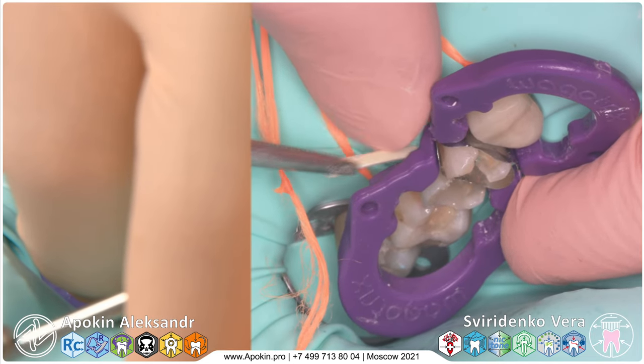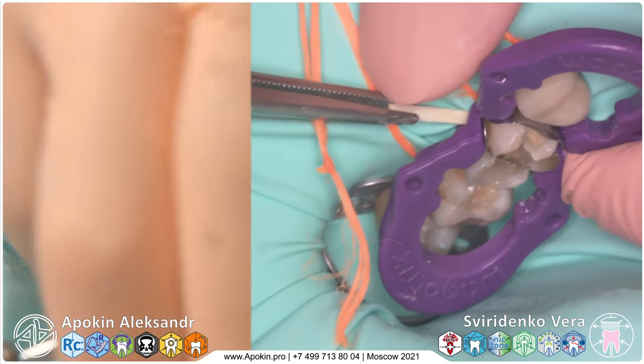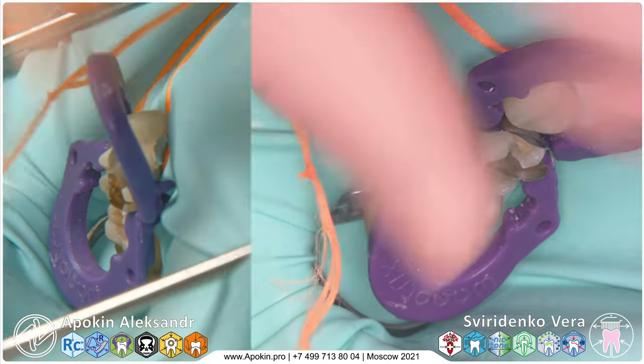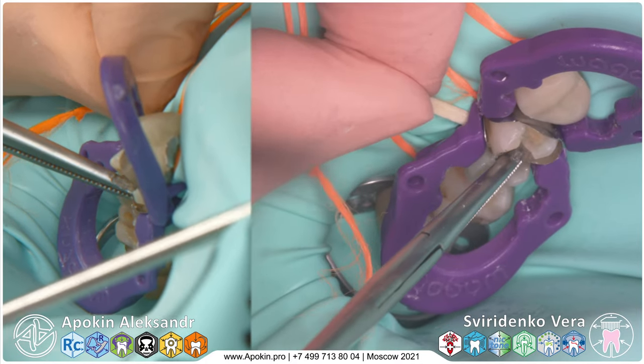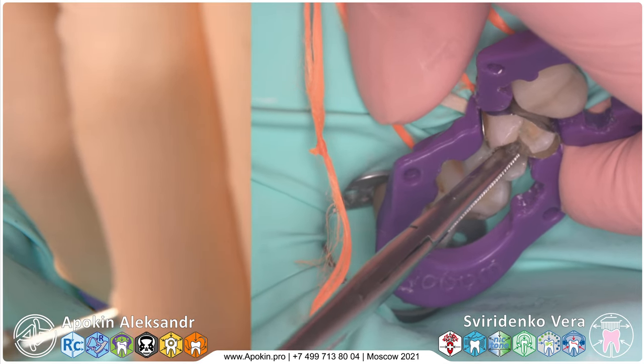For more precision, fix matrices in interdental spaces between 15 and 14 with an interdental wedge. Very important to check that the matrix is placed correctly during this procedure.